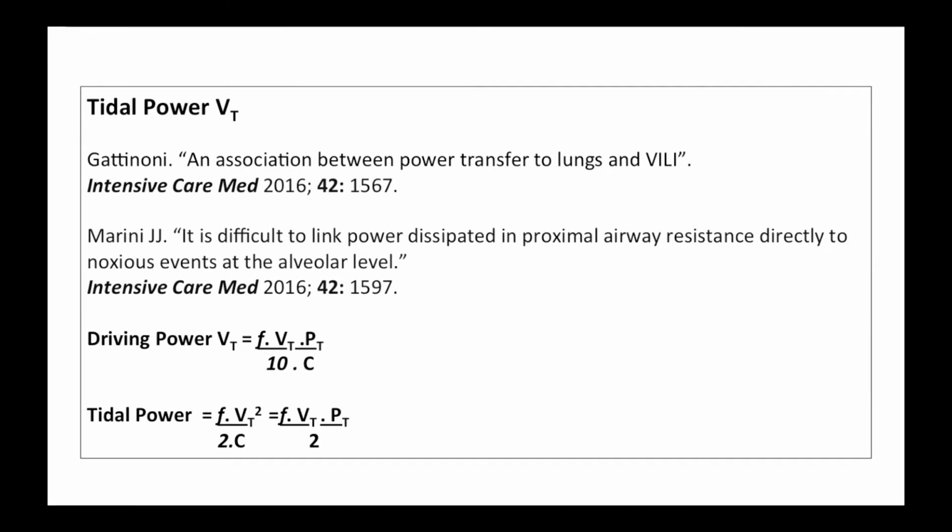In terms of the driving power, we can derive an equation based on the tidal volume. And we can also do that for tidal power. But I don't believe that there is really a dispute between these two ways of thinking. I think they are different.